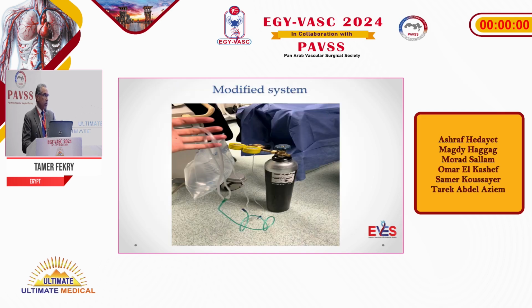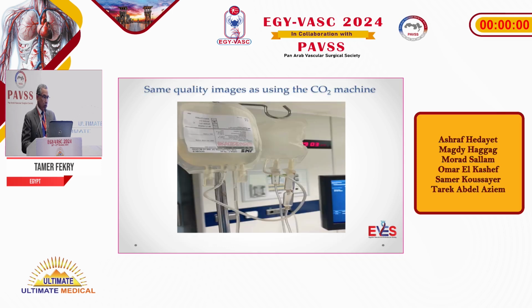So we used the CO2 cylinder that is used for laparoscopes, and this is our reservoir bag, the Foley catheter bag or the urinary catheter bag. We can also use the blood collection bag. All you need is to collect from the cylinder to this reservoir and to take from this to the patient.